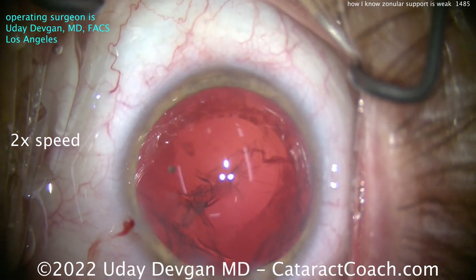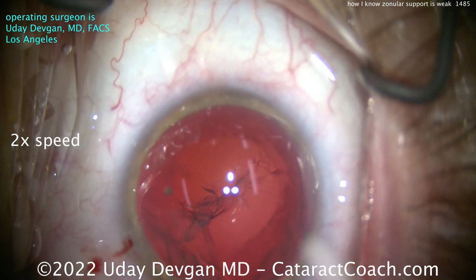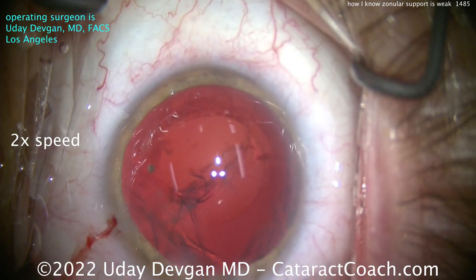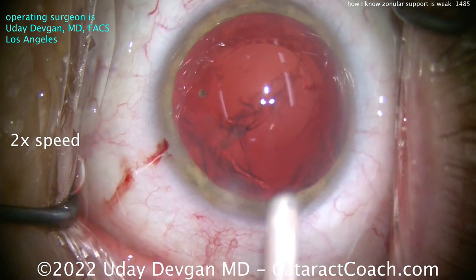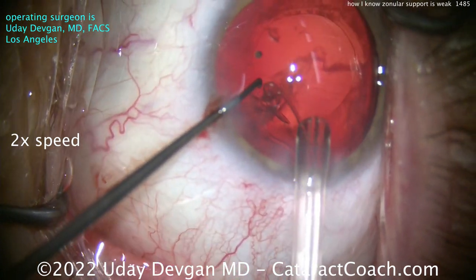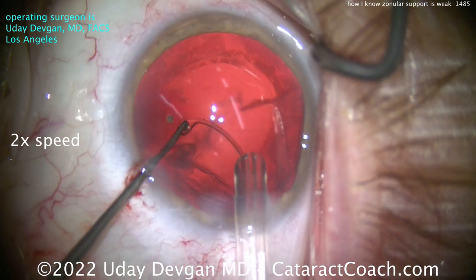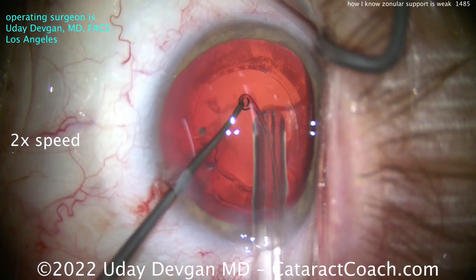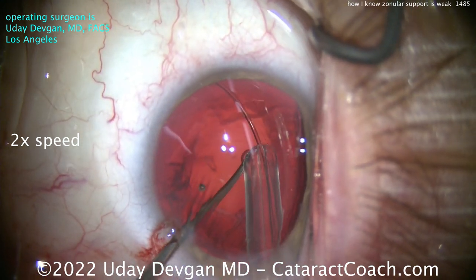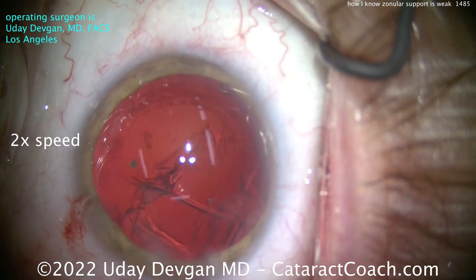Let's place the CTR. Open the CTR for me — it's going to take me a couple of tries to get it right. I'm going to use a Sinsky hook in the non-dominant left hand to help guide it through the single eyelet. Get that in the eyelet — not quite, try again — and now I'll deliver it. Look how I can guide that into position, then release both ends and it goes in the bag. Nice placement of the CTR.